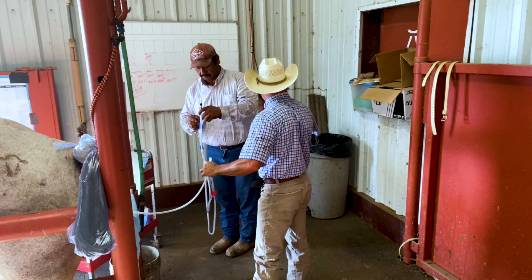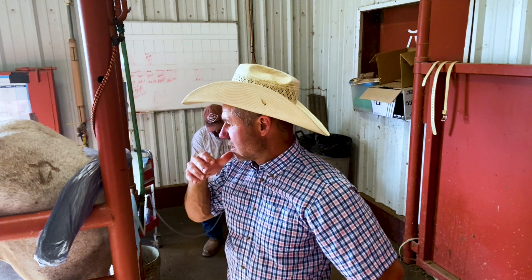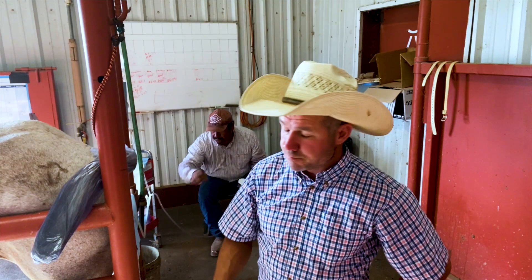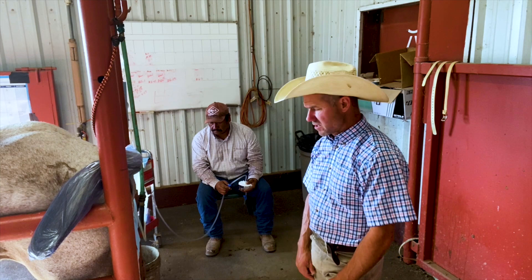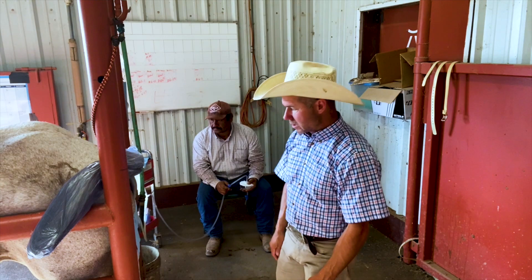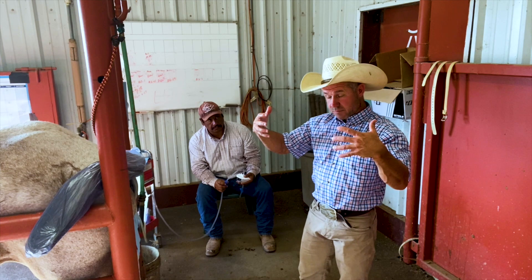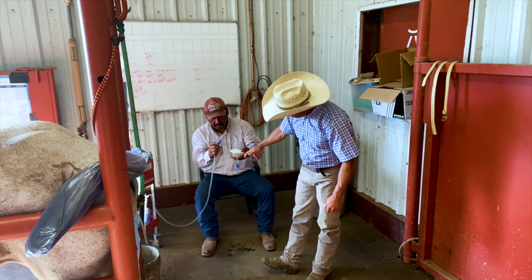So this is my catheter. Now we're attaching a Y-tube. We're flushing this mare — we bred her about eight days ago, and she ovulated seven days ago, so now we're going to flush the embryo out of her. The reason we're flushing this mare is she's a great mare but she's injured herself — hurt her stifle. We shipped in semen from Metallic Cat, a big-time stud at $10–15,000 stud fee. We've got a recipient mare lined up for this. I've got the catheter in there; when it goes in we blow the balloon up just past the cervix so it's pulled against the cervix. We fill it full of flush fluid, and with this Y-tube I'll run it back down through this filter. We've created a vacuum in this filter and there's a screen in the bottom that will catch the embryo.